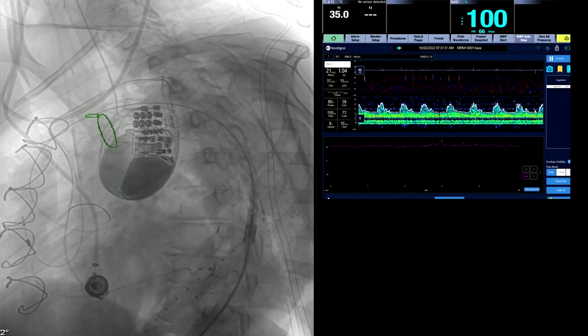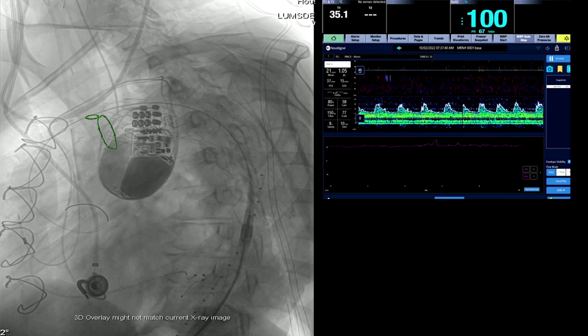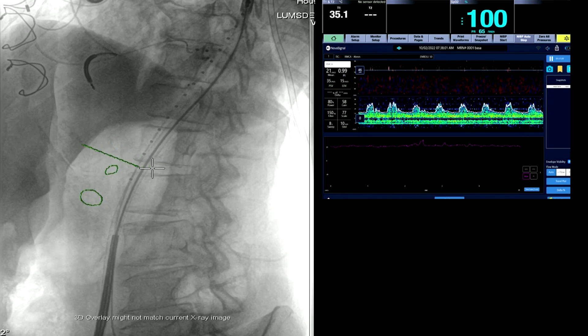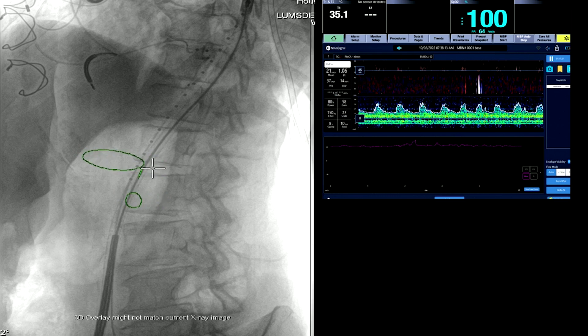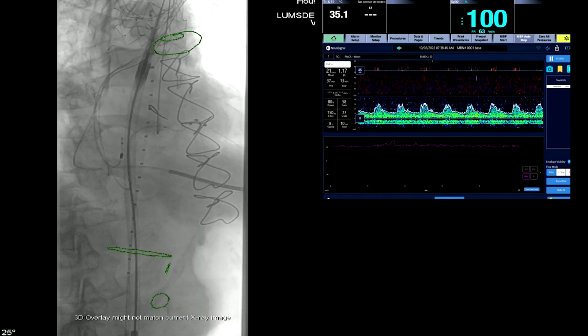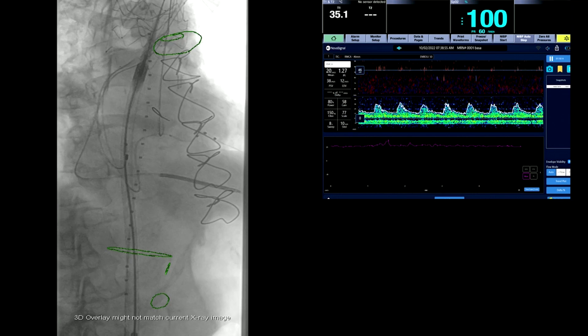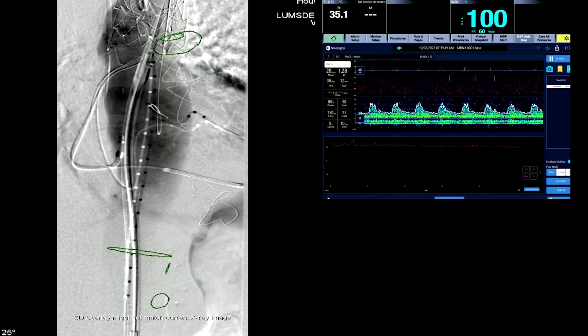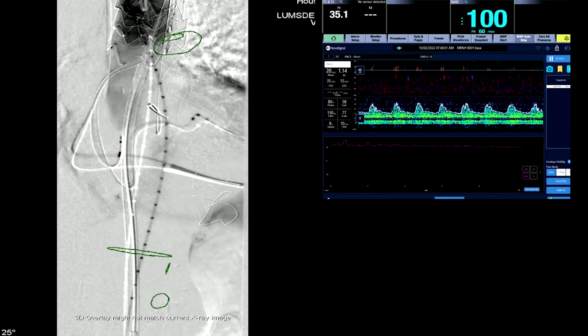The delivery system is then removed. The reason these fusion marks move is because we're moving the image intensifier. You can see at the bottom end we've also marked the aorta, the celiac, and the SMA. In theory, if you're orthogonal directly across the aorta, it should be a horizontal line. This patient has an elevated creatinine, so we're trying to minimize contrast — that's why the fusion marks are really important.